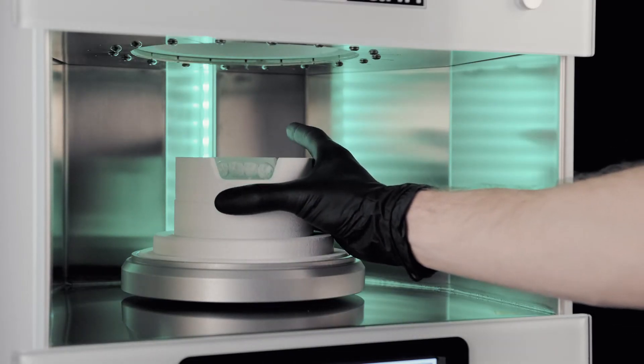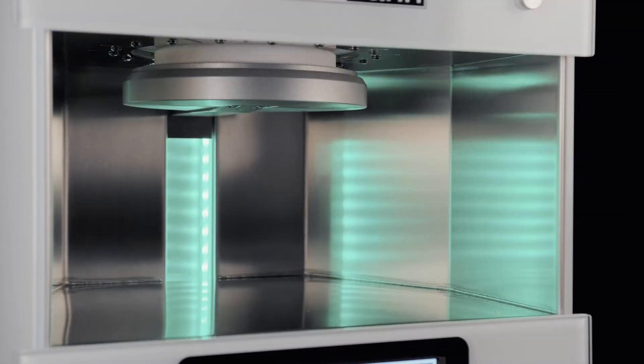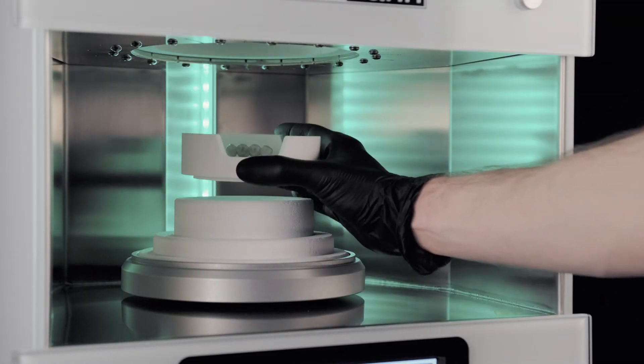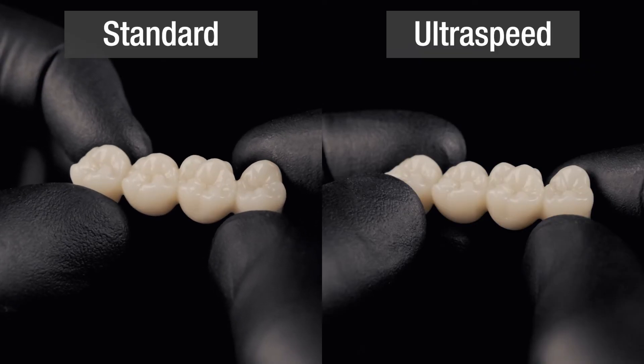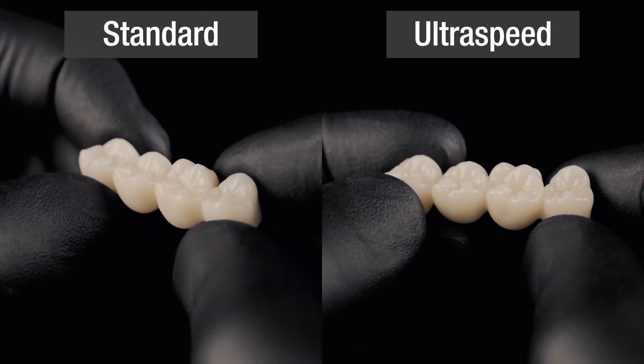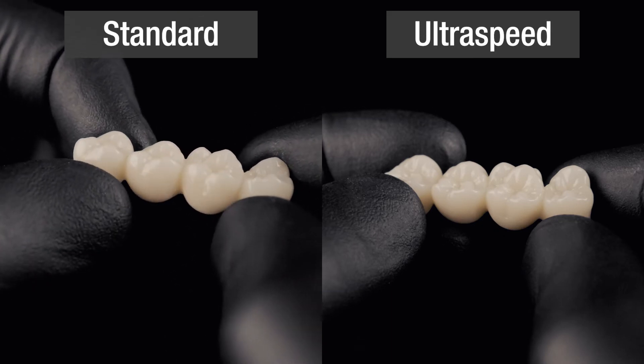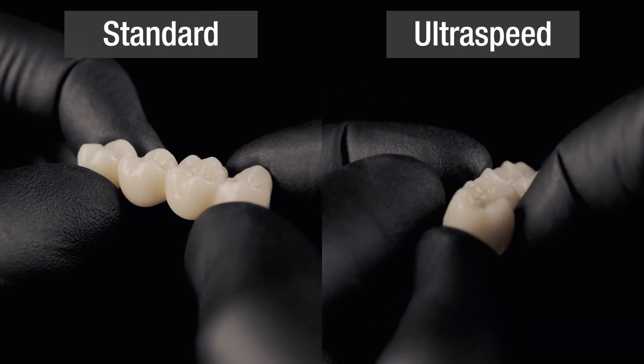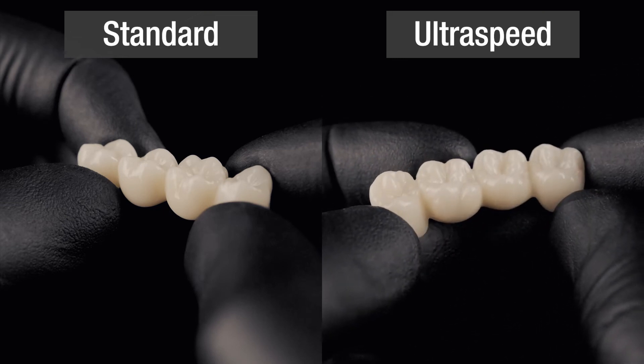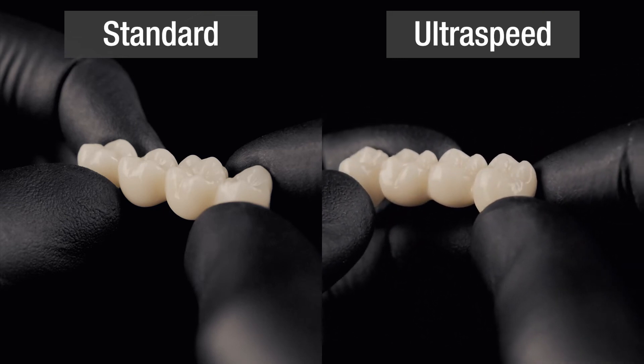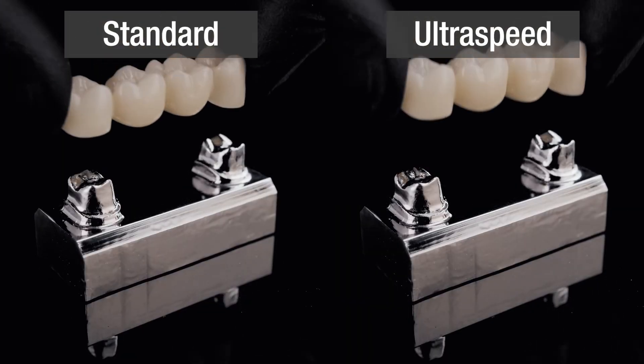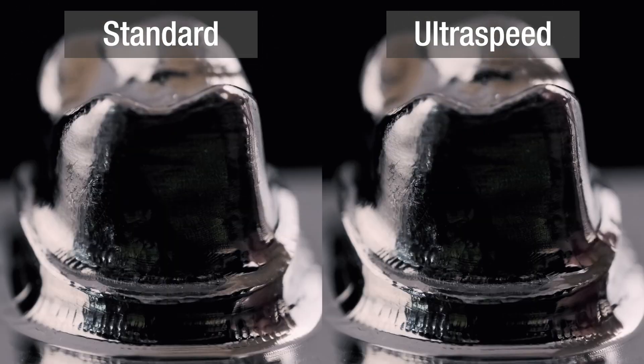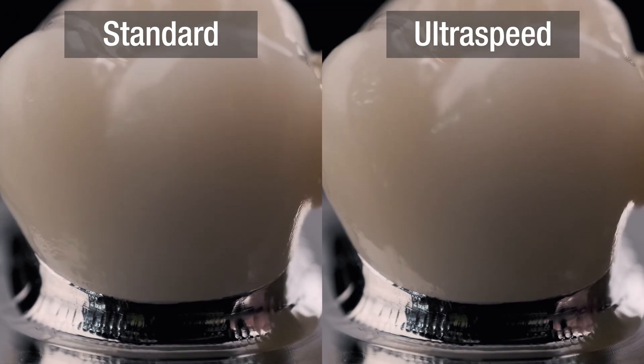Let's take a closer look at the precision of the ultra-speed programs. On the left, we sintered a 4-unit bridge with the standard program in about 8 hours. On the right, we sintered the same structure in just 1.5 hours with the ultra-speed program, saving time and energy. As you can see, both bridges show an extremely accurate fit adjustment after sintering.